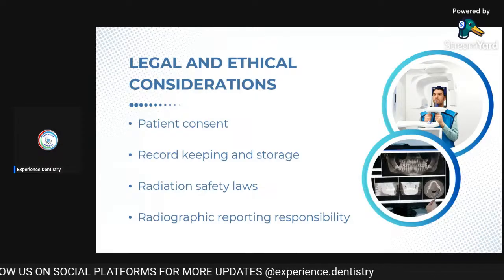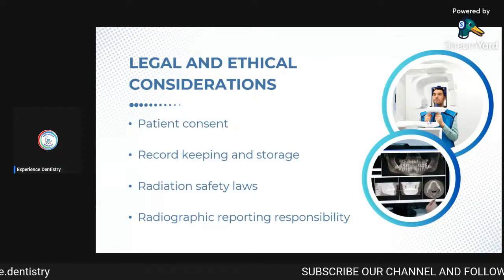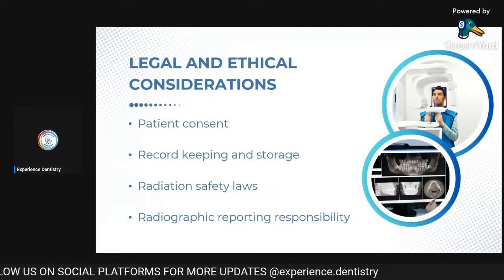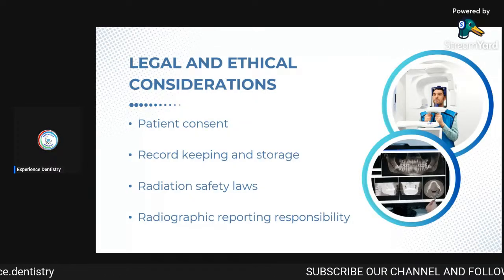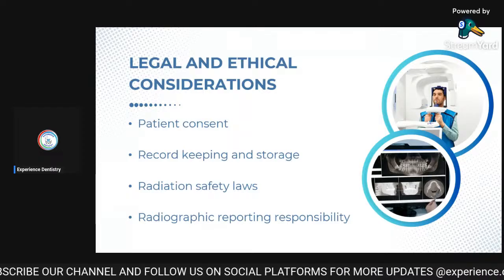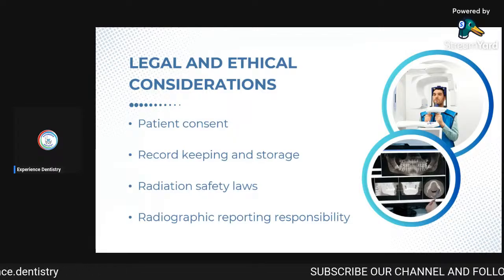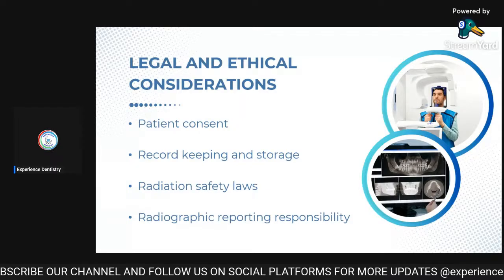Then again, as I said, you have to follow the radiation safety laws in all terms. If and only if you see that the patient needs a dental X-ray, go for it. If on clinical inspection you find that the case can be managed without it, like in cases of fillings or a little crown cutting, there is no need to take an X-ray. But in cases of irreversible pulpitis with severe pain, or when you need to do orthodontic planning, then you need to take an OPG. And when you are going for an implant, it is very important. Then, radiography reporting responsibility: it is your responsibility to make sure that the radiograph is taken correctly.